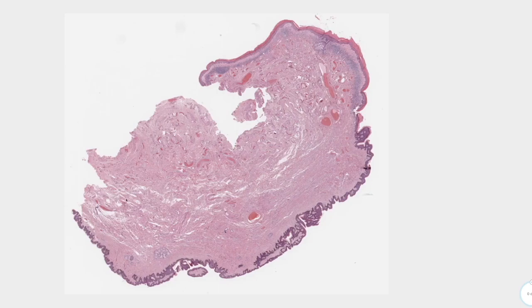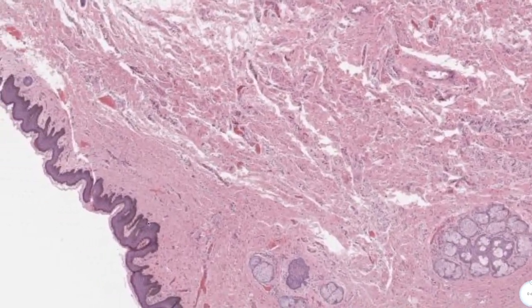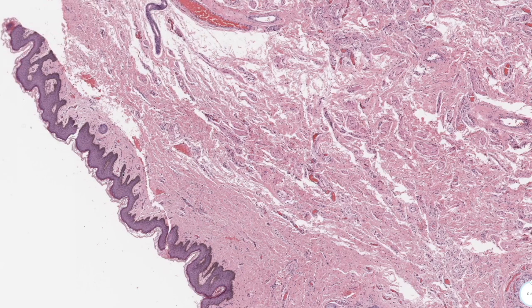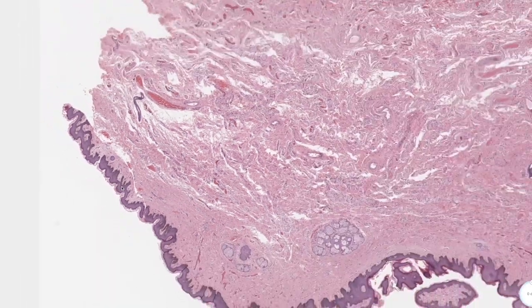At low power, we can see that this area looks quite different from this area. Looking at the normal area more closely, we can see the epidermis with these projections called rete pegs, or rete ridges — those are the ones visible here.